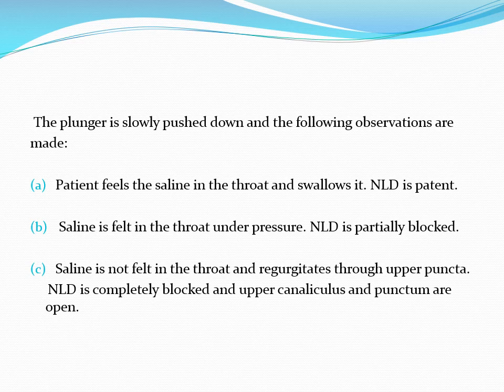The plunger of the syringe is slowly pushed so that the saline flows through the lacrimal cannula, and there are various observations. If the patient feels that the saline has flowed into the throat and swallowed it, then it means that the NLD or nasolacrimal duct is patent. If the saline is felt in the throat only under pressure, then the nasolacrimal duct is partially blocked. If the saline is not felt in the throat and it regurgitates through the upper punctum, it means that the NLD is completely blocked and the upper canaliculi and punctum are open.